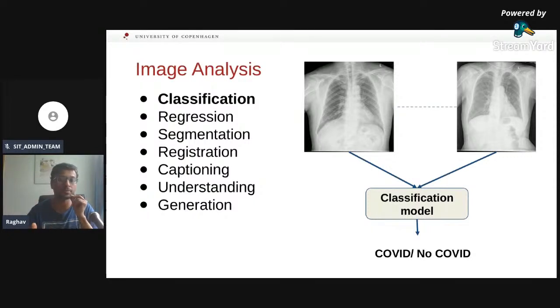Now the problem could be, in this case, it's not doable as yet. There are models which claim to do this, but there's no established result on whether it is good enough to use in the clinics or not. So for instance, if you give a scan to a particular model and you want to say if the patient is infected with COVID or not.